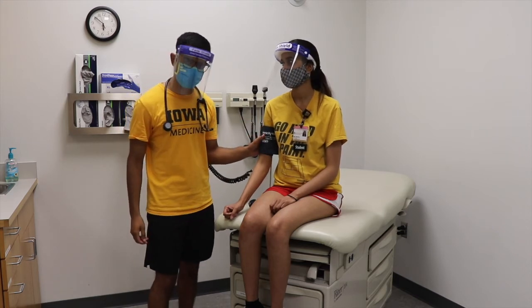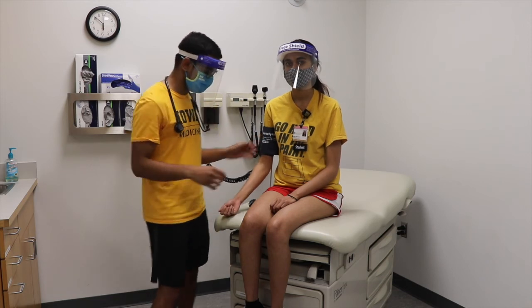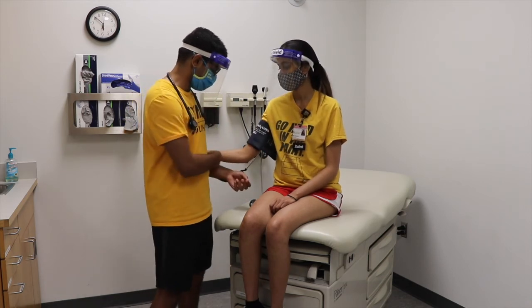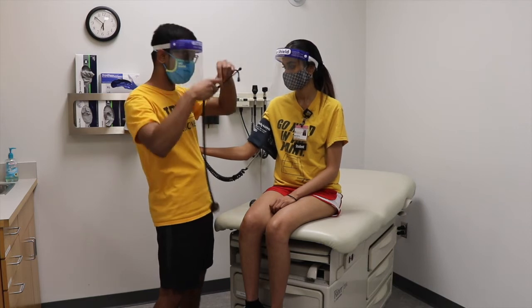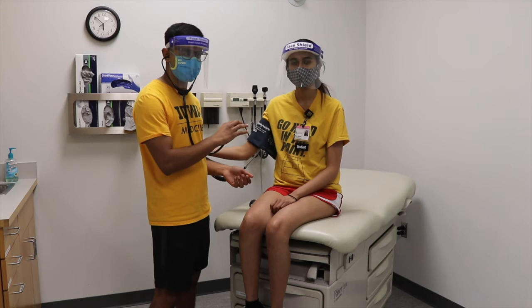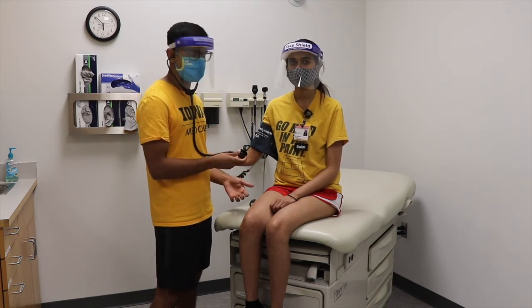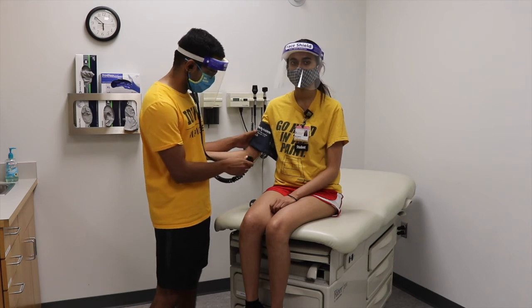All right, so now we're going to measure Mala's blood pressure, and to do that, we place the blood pressure cuff on her arm an inch above her inner elbow. And next, what you want to do is support their arm, put on your stethoscope, and make sure they're relaxing their arm while we're doing this, because if they're flexing their arm or something, that's going to change the value.